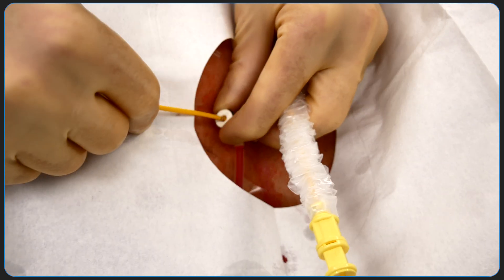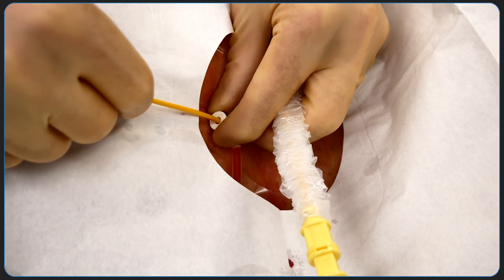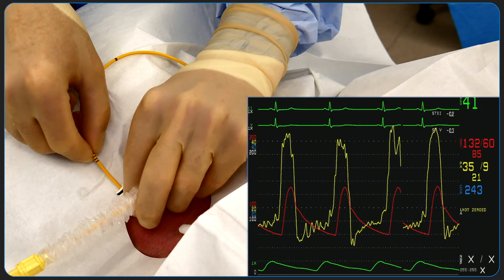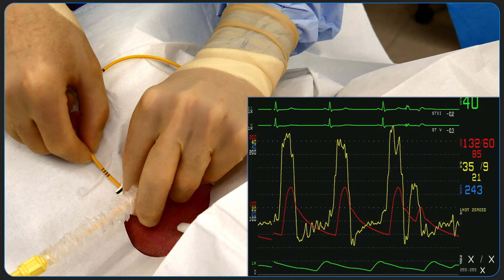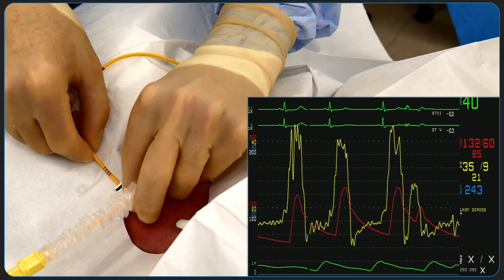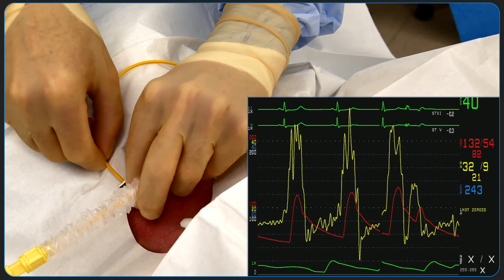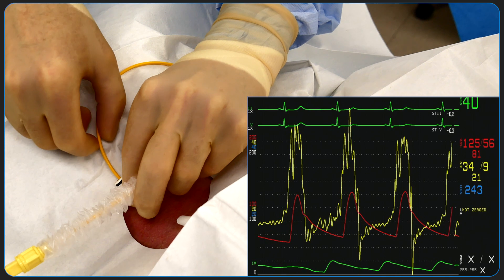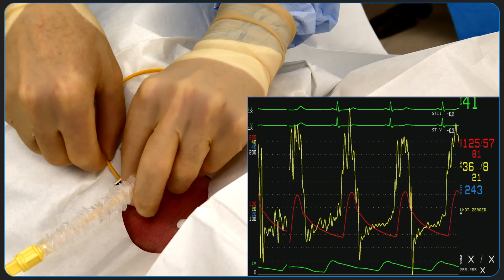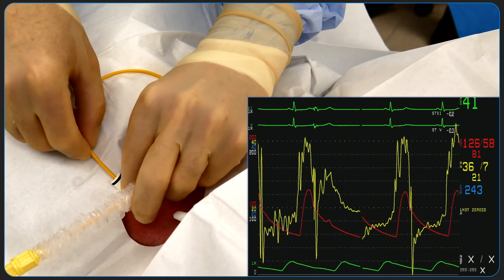The pulmonary artery, or Swan-Ganz catheter, is a balloon flotation catheter that directly measures multiple physiologic values. In this demonstration, we will review the anatomy of the catheter and the pressure waveforms obtained as the catheter is floated into the pulmonary artery.